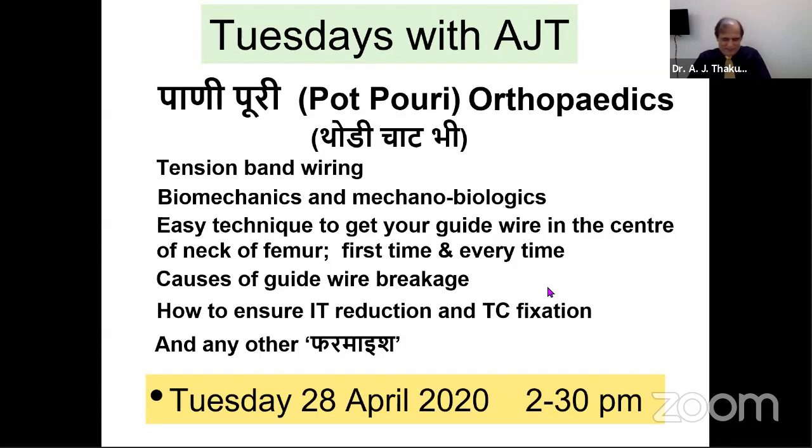Yeah, I thought today's presentation, I was quite excited about those concepts of inserting the monofixators in the line of the loading. That is a concept which I gathered only from your lecture. Before that, I wasn't aware. I thought that's a very good concept, that we analyze which side the load affected the fracture. And depending on the triangular part of the butterfly, you can judge it and then place the stabilizer in the plane of the offending load. I thought that was very good.